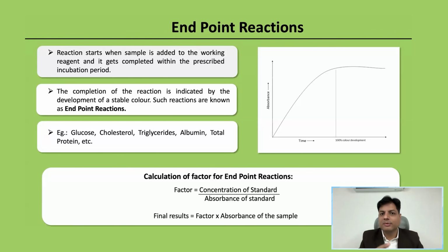Each of these analytes will cause a disease because their concentration increases or decreases in the blood. Therefore, we use this method of endpoint calculation of the reaction.